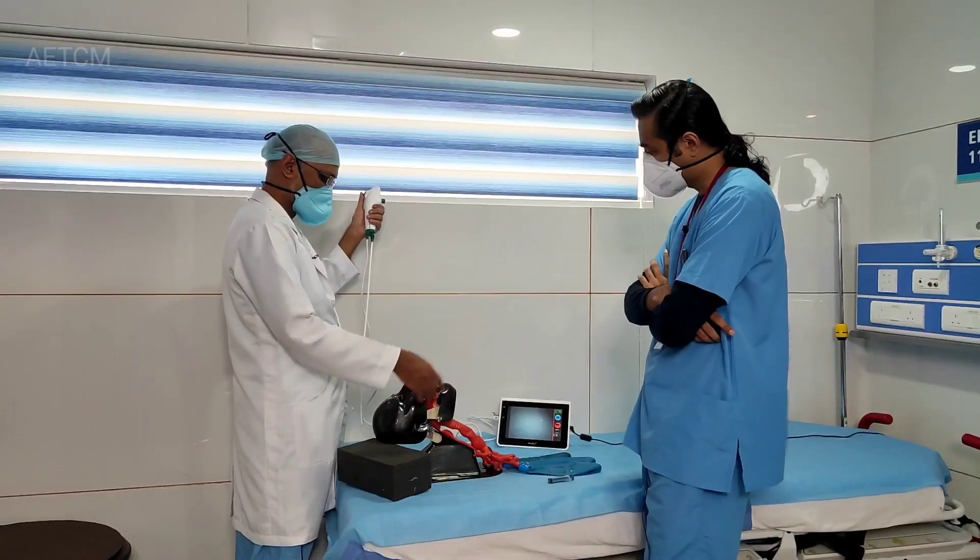Now you can see the tube — I am inside and I can see the carina down there. The tube is just about fine. After that you inflate the cuff and then connect to the ventilator.